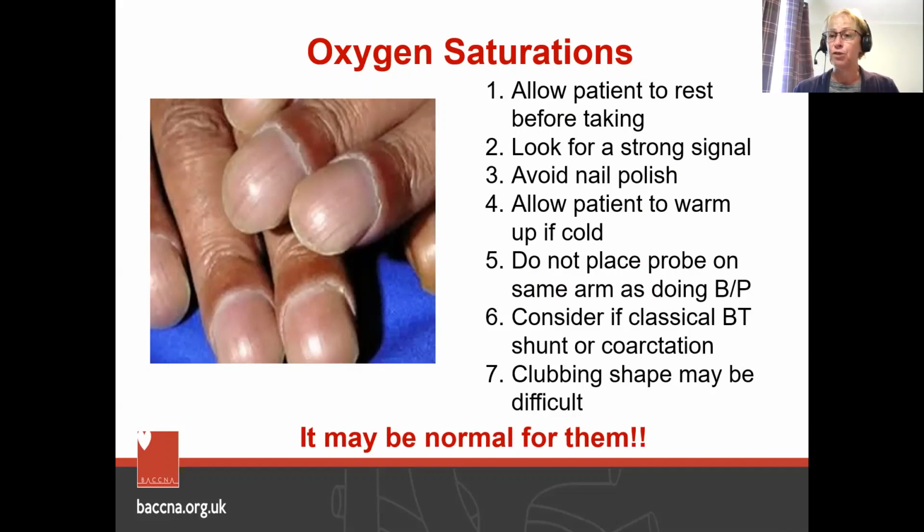It's important to note other factors as well that may influence accuracy of the results, such as movement. Do they have cold hands? Are they wearing nail varnish that should have been removed? Clubbing of the fingers, such as in the picture here. And where oxygen saturation monitoring is indicated, then a respiratory assessment and measurement of the respiratory rate should be performed at the same time to give you a complete picture.